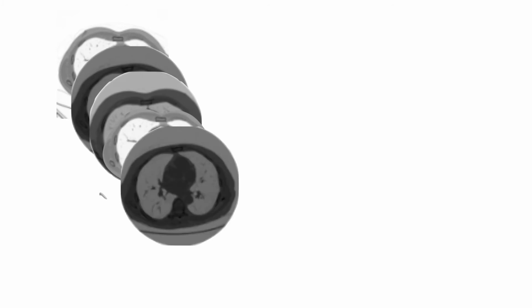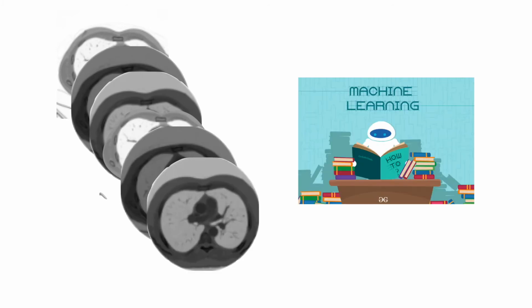But how can we put this knowledge about our images into the reconstruction? The answer is that using high doses of measurements, we're able to produce a large number of good reconstruction images. Using this collection, we can use machine learning to actually learn from the data directly how good reconstructions are supposed to look like and what separates those from the noisy images we obtain without putting prior knowledge into the reconstruction.